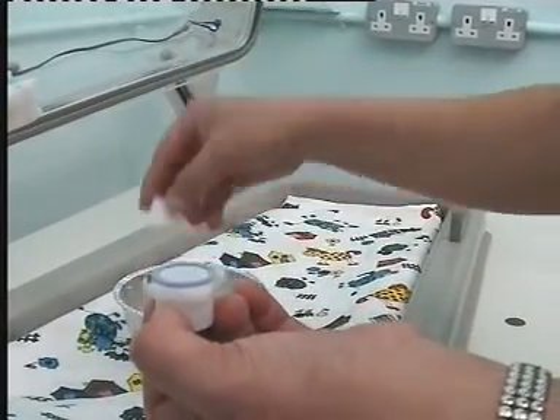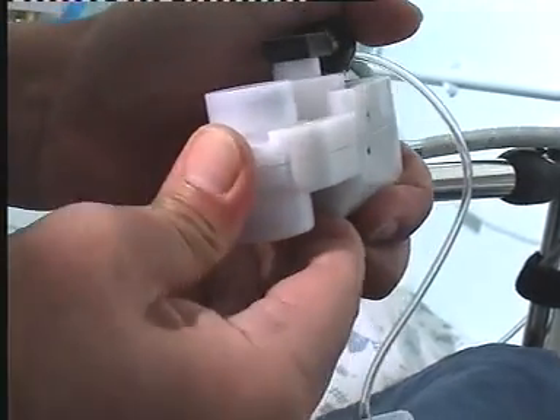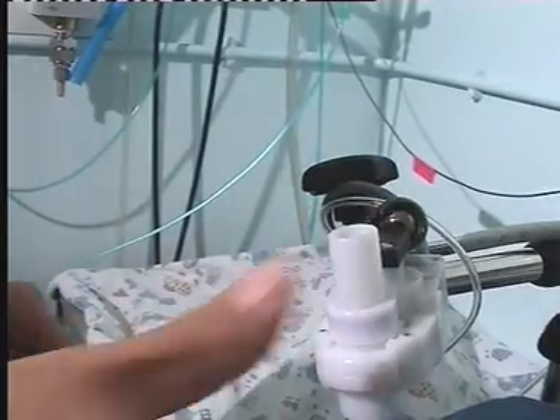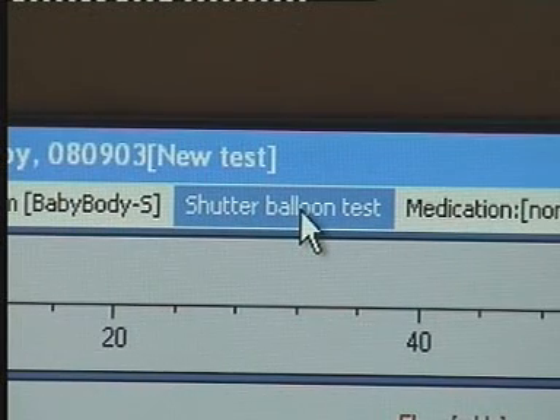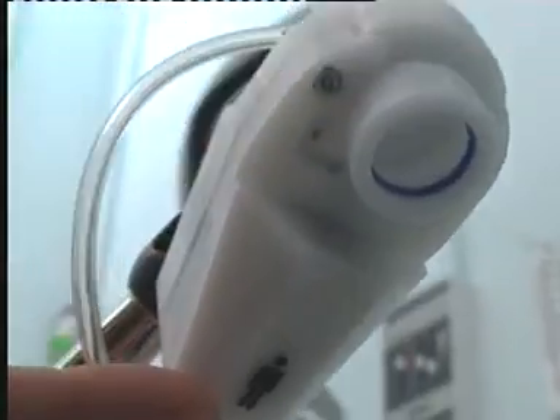Here you can see the pneumotach being assembled and placed within the transducer housing. The low dead space shutter is then clipped into place. A balloon shutter test is performed to ensure that occlusions can be held up to an airway pressure of at least 3 kilopascals. The patient icon must face towards the patient when in use.